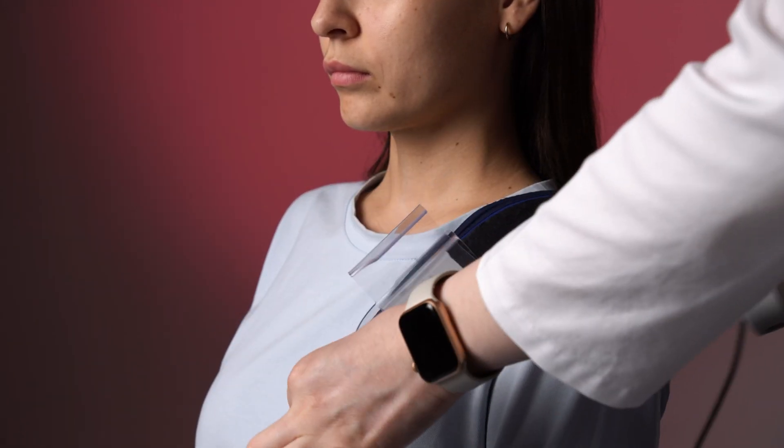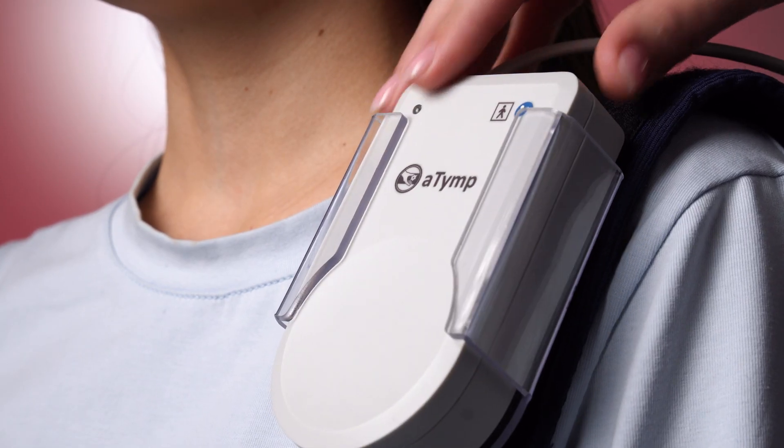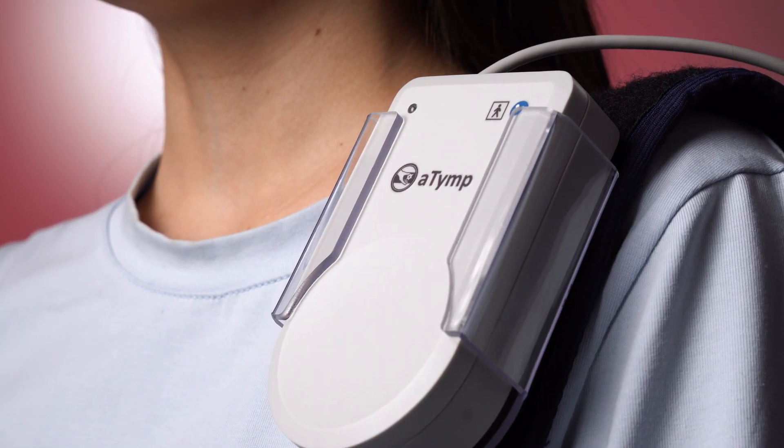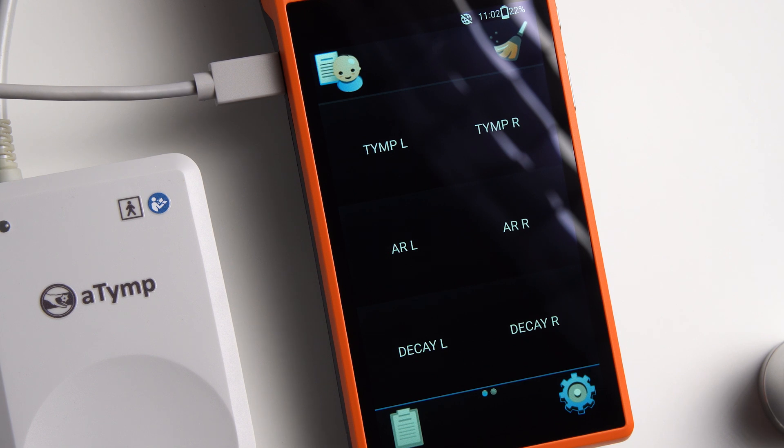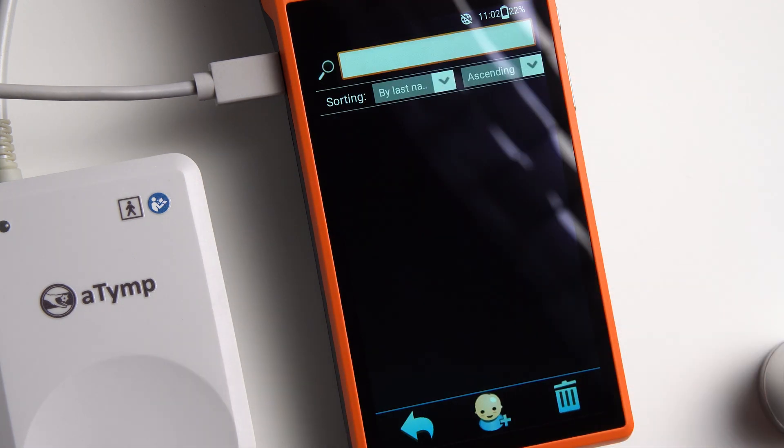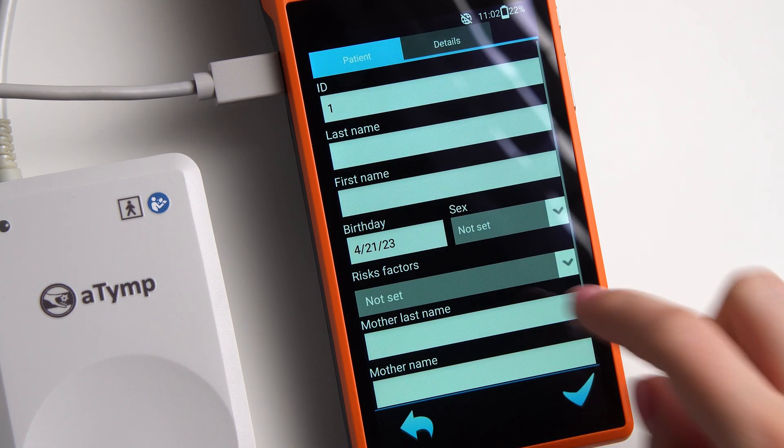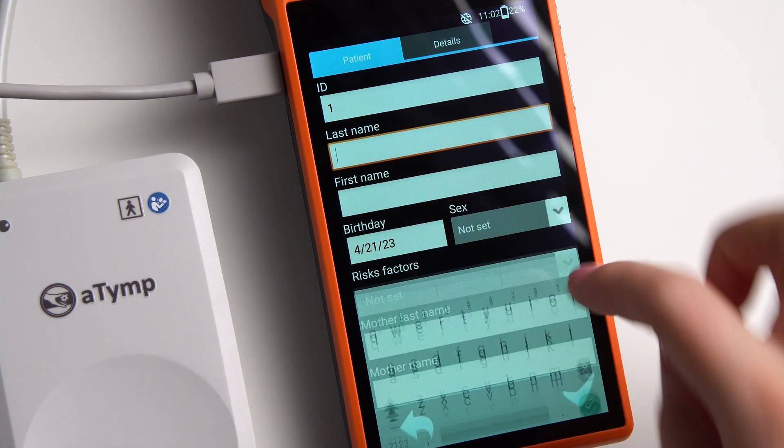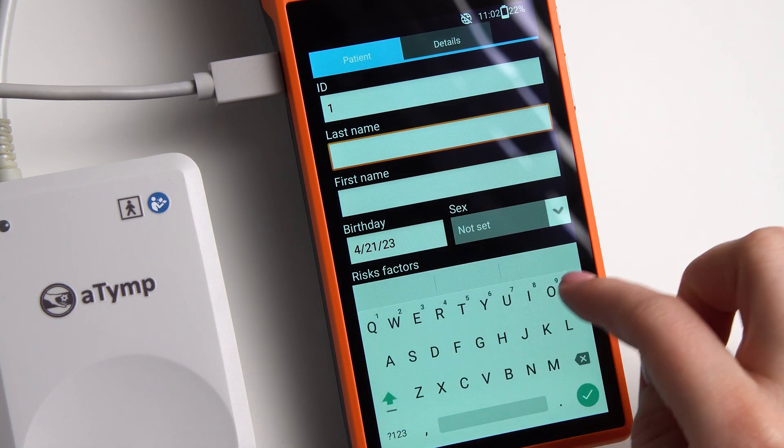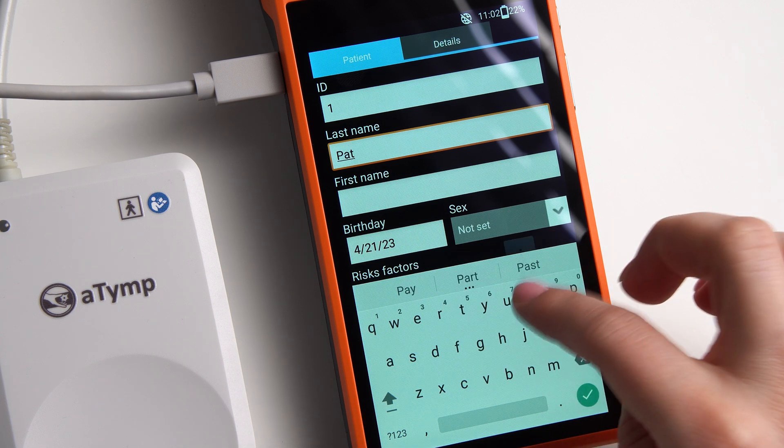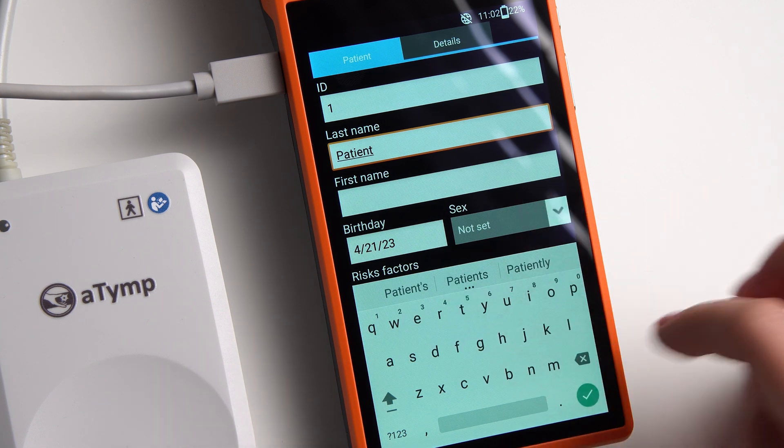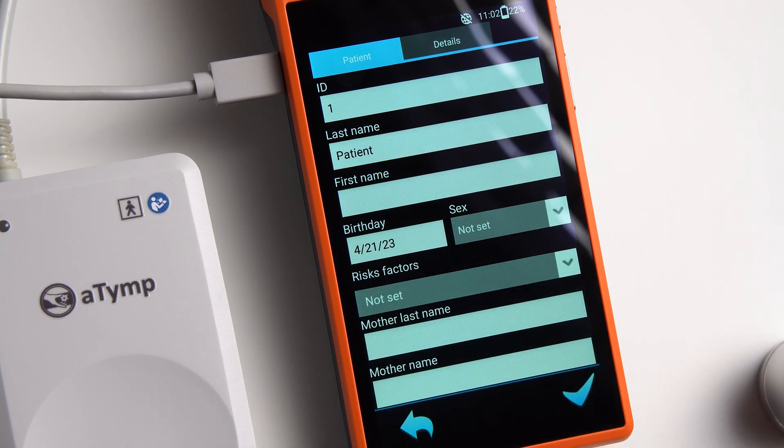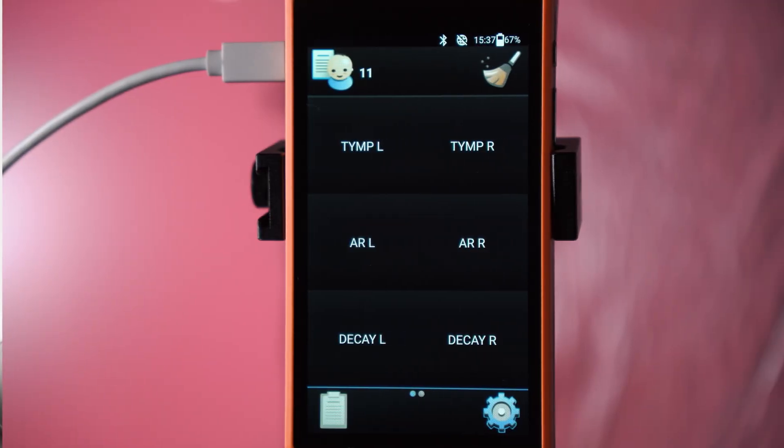Place the unit on the patient using a special shoulder harness. Before starting the examination, we create a new patient in the database. Enter the name, last name, and date of birth. You can also enter other data if necessary. Press the check mark in the bottom right corner.